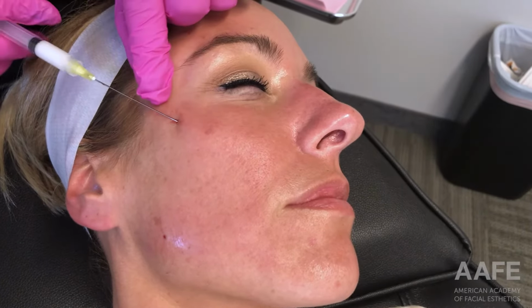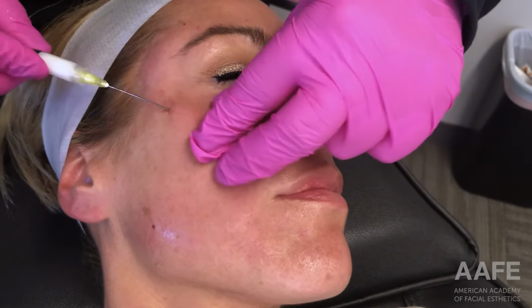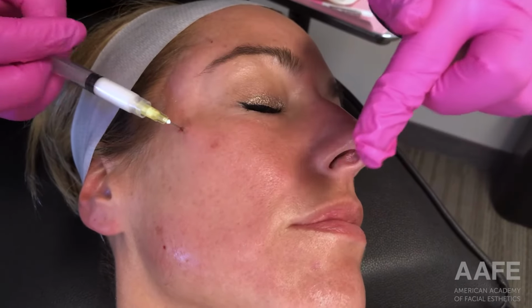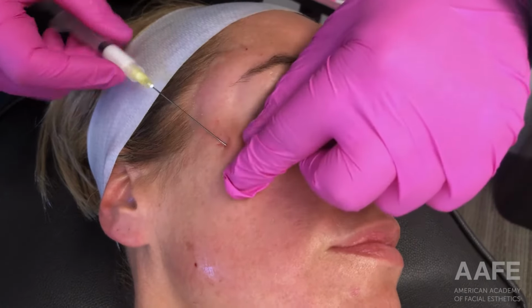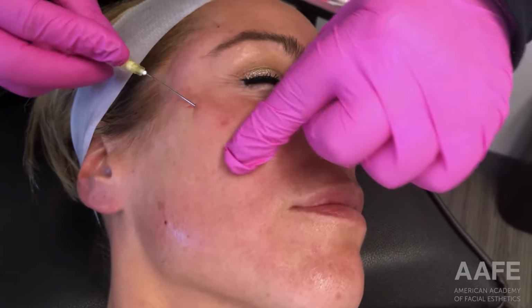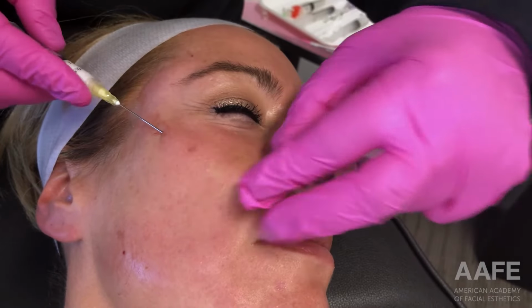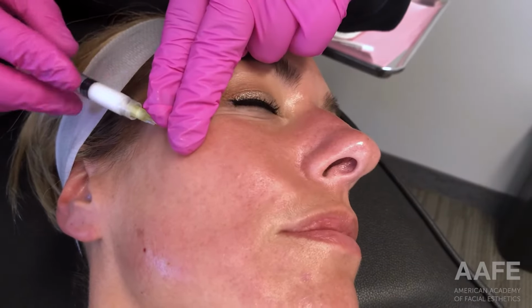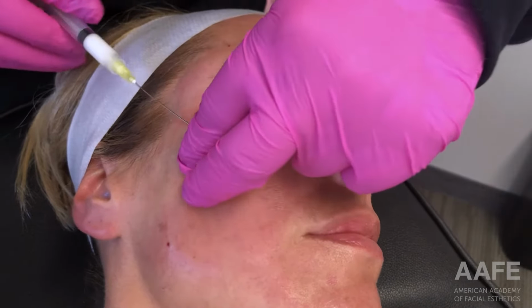You can see the treatment is fairly comfortable for this patient. Again, there is lidocaine in the Radiesse, and then I used lidocaine to numb that entry point as well. So of course, anytime with a cannula, occasionally you can experience a little bit of pinchy areas, maybe coming through ligaments or pseudoligaments, but overall the procedure is fairly comfortable for the patient. You can see she's doing quite well. And we're maintaining that immediate subdermal plane to place the Radiesse. Always in a retrograde fashion, the only time that you're injecting is on the way out.